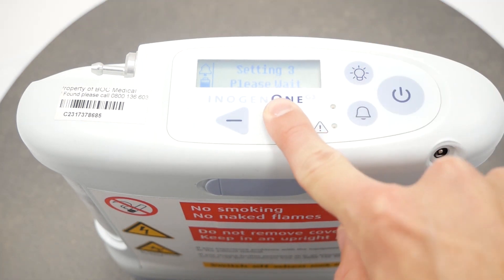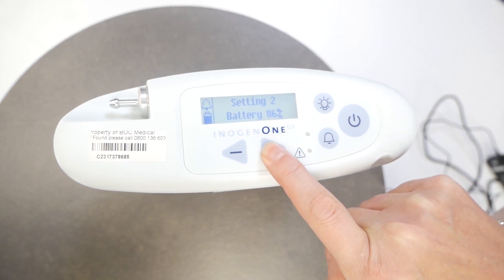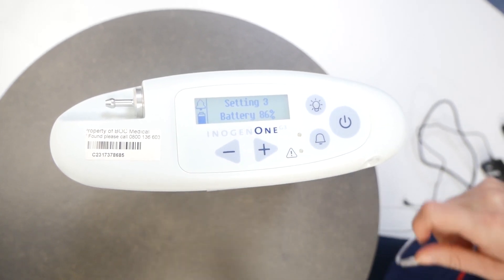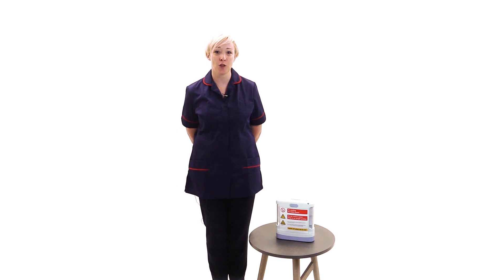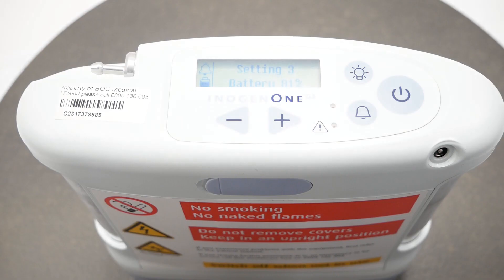The flow control buttons. By using the plus or minus buttons you can change the settings shown on the display. Remember you must not alter your oxygen settings unless instructed to do so by your healthcare professional.